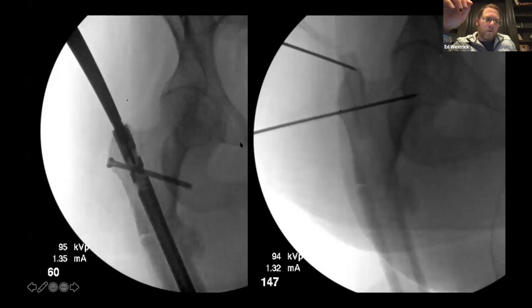In this pattern, a subtroch, I would argue you need more than one screw, and you need the recon style screws. So for a subtroch, having the recon style nail with two screws, you really shouldn't have a cutout pattern. There's no inner troch component, there's no compression of the fracture site. None of that should be an issue.